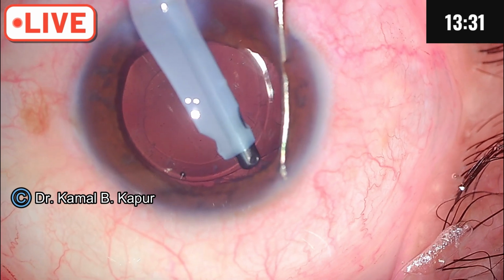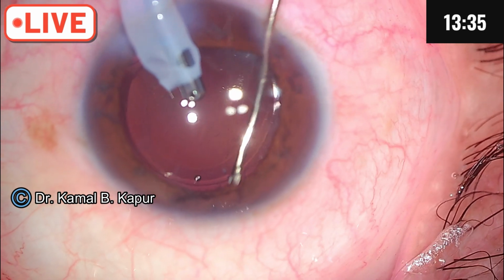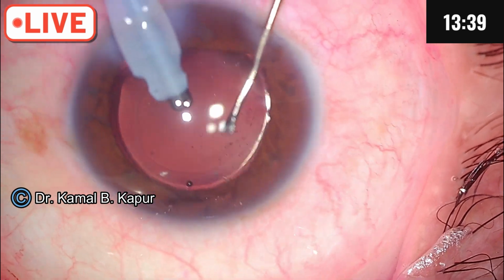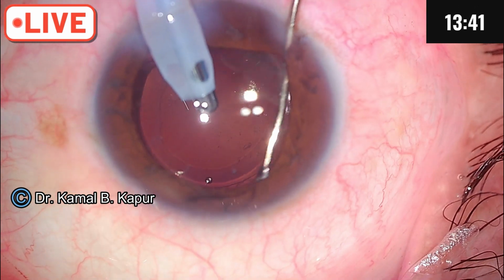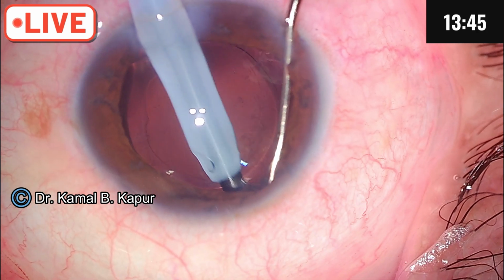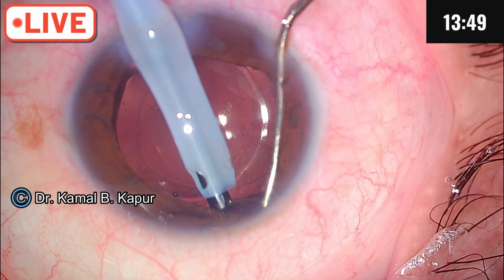So the advantage of having one spare instrument, I think it's stuck badly behind the sometimes this can fluff up and come after a couple of days. I will again attempt it slightly.